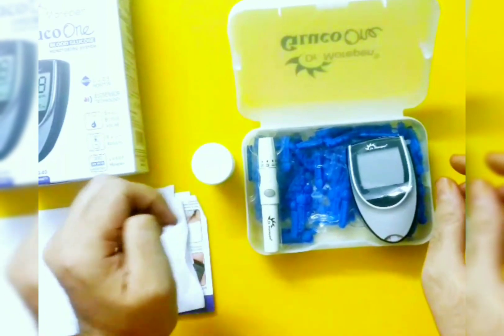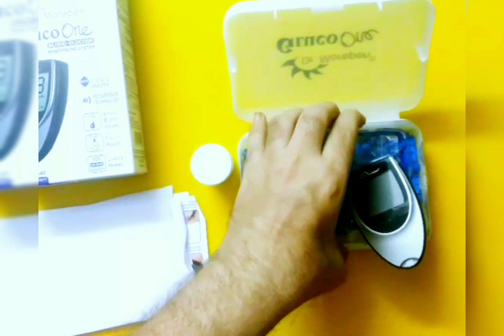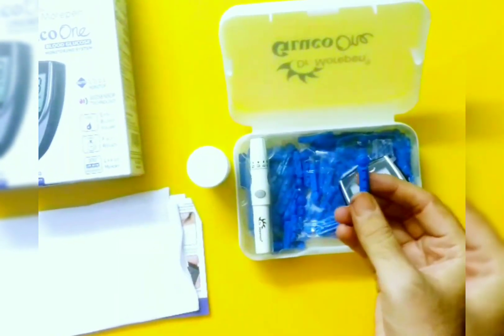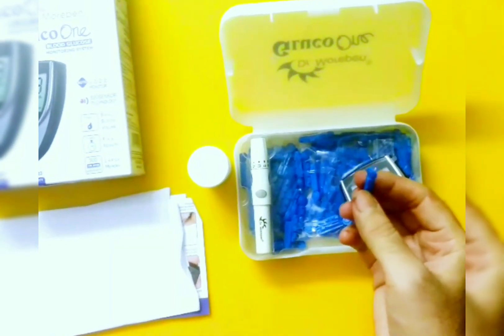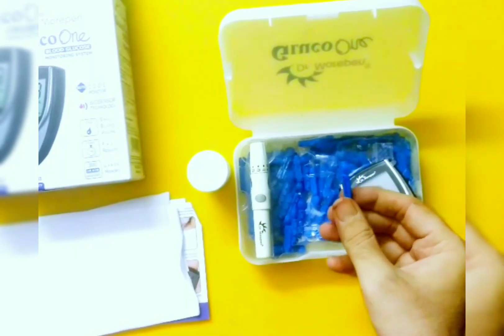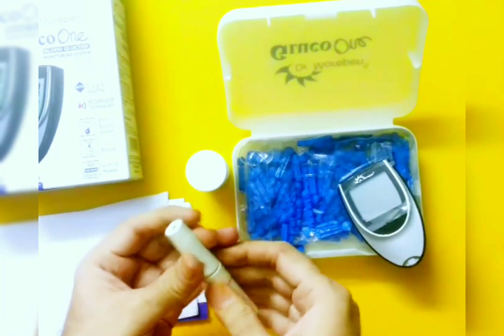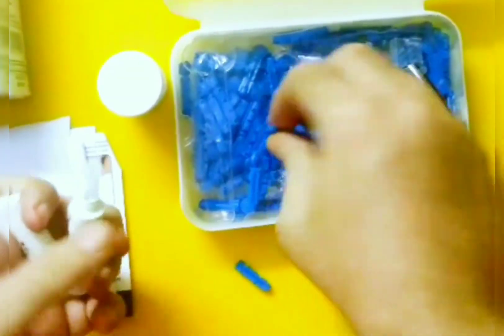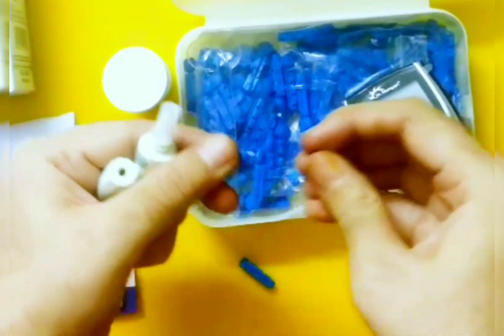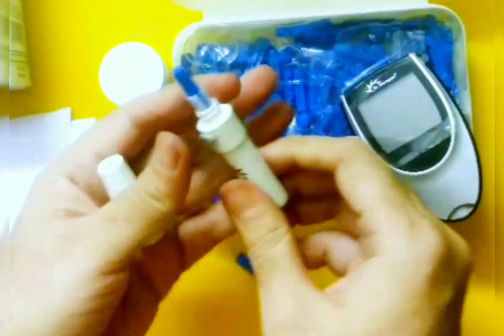Now let's do a small test. Take a lancet — as I said, it comes with 10 lancets in the box, but you can easily buy a pack of 100, which I bought for around 200 rupees. This is the lancing device. To prepare, take out the pin, latch it in the lancing device like this, and just close it. The lancing device is now ready for testing.